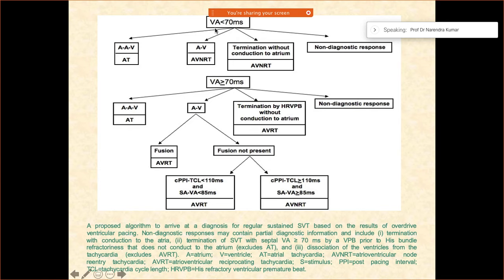First of all, if the VA interval is less than 70 milliseconds, this is a very important and very nice algorithm. If it tends to terminate without conducting to the atrium, definitely it is AVNRT.